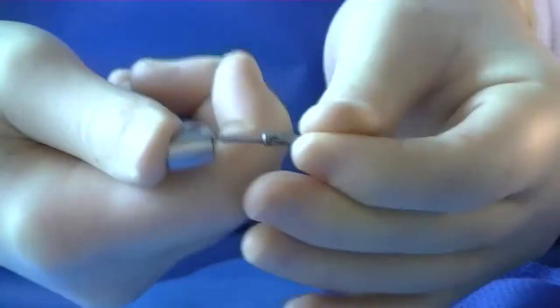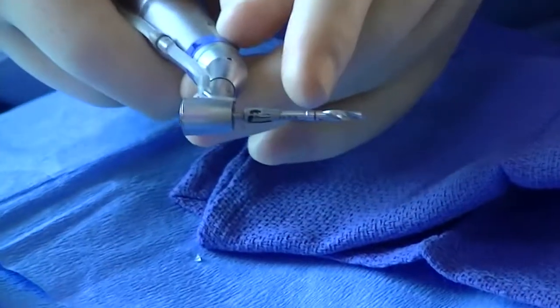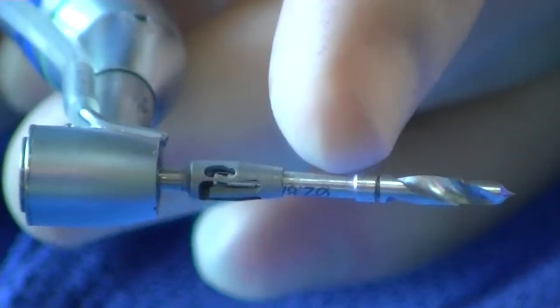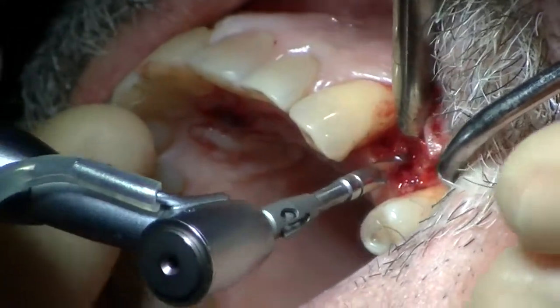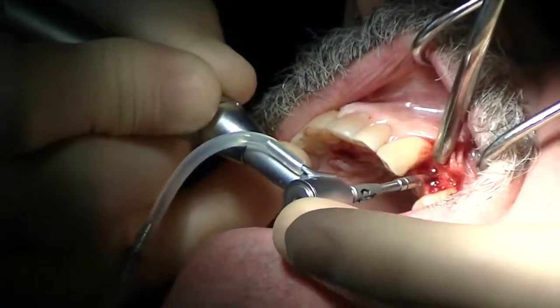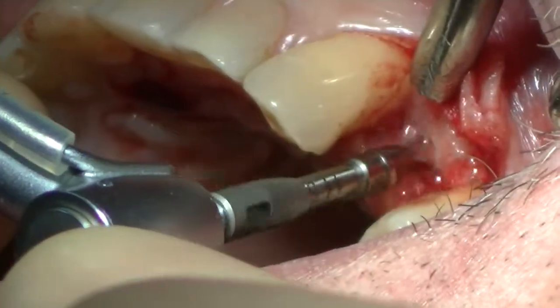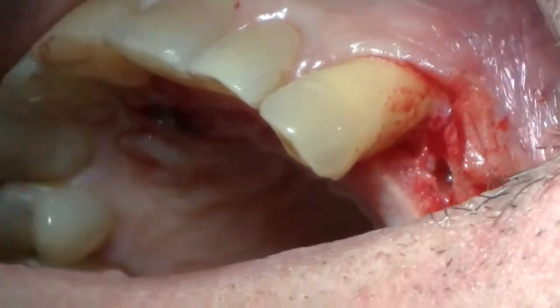I'm then going to take my 3.0 diameter Han surgical burr, and you can see I'm going to do an 11.5 here, and you can clearly see the marking. And because I can see the hard tissue, I will go to the crest of the ridge. And again, using two fingers is sometimes difficult for video demonstration. It looks like I'm in pretty good position, and I'm simply going to final position.